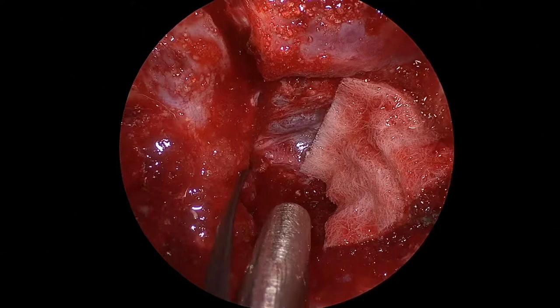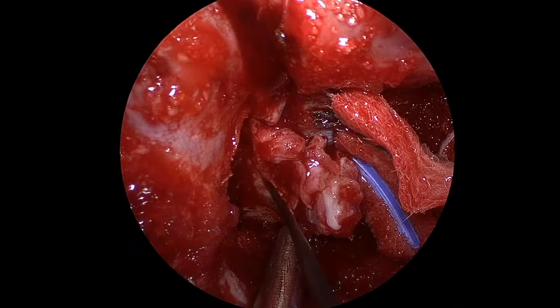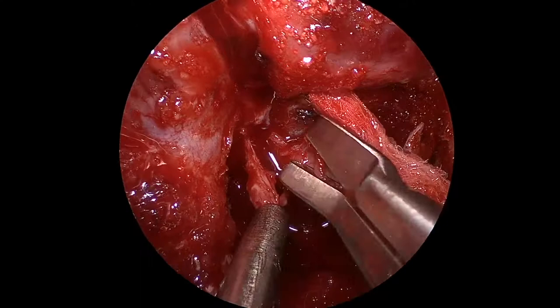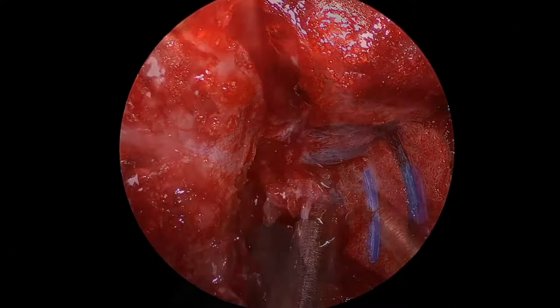I'm seeing now the sixth nerve at the interdural segment, now on the left side, and now on the right side. I'm cutting the dura around Dorello's Canal, making sure with electrical stimulation that I am preserving the abducens nerve. It is very important to reach the limit. This is the inferior petrosal sinus bleeding there. I trim all this dura because it's potentially involved with tumor. That dural thickening there is the petrosphenoidal or Gruber's ligament, located just posterior to the abducens nerve.